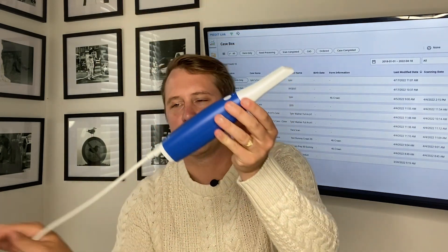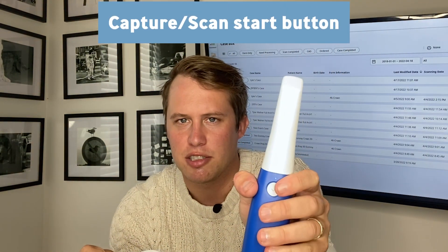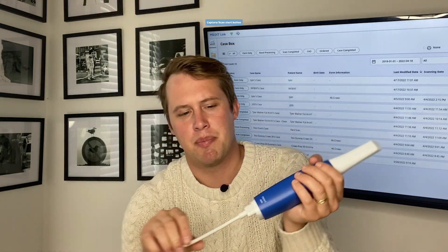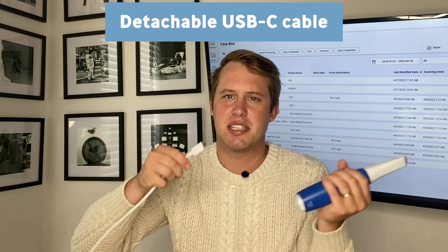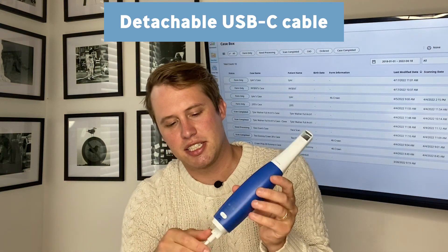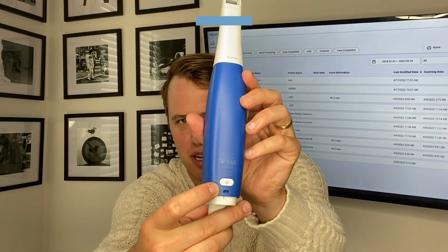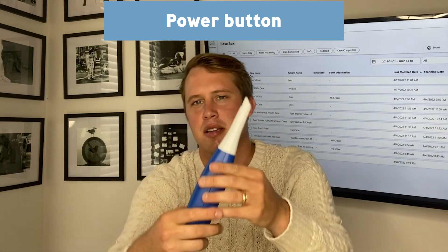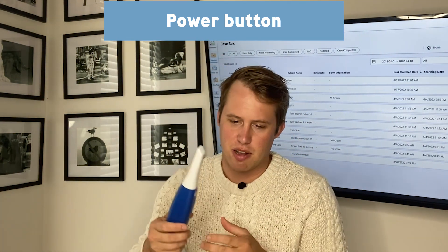The capture button icon located here allows you to press once to start and press once to stop. It has a detachable USB-C cable here which easily attaches and reattaches. And your power button is located here — just hold that for about two seconds before the scanner reconnects to the software.